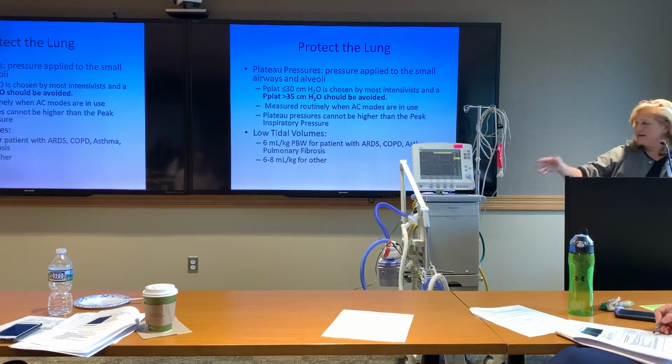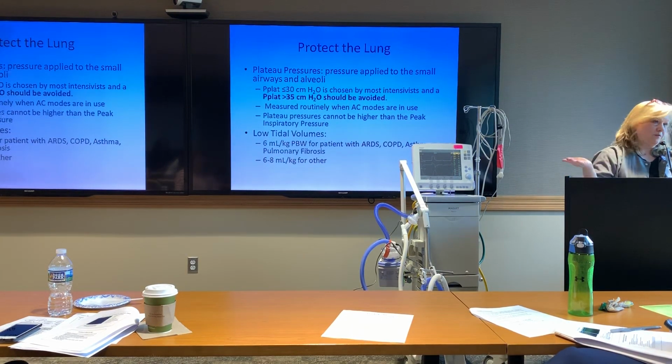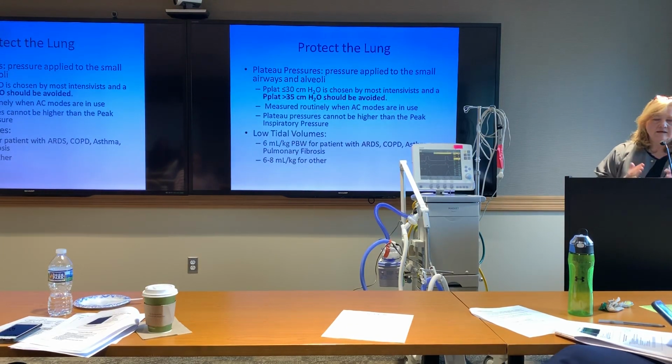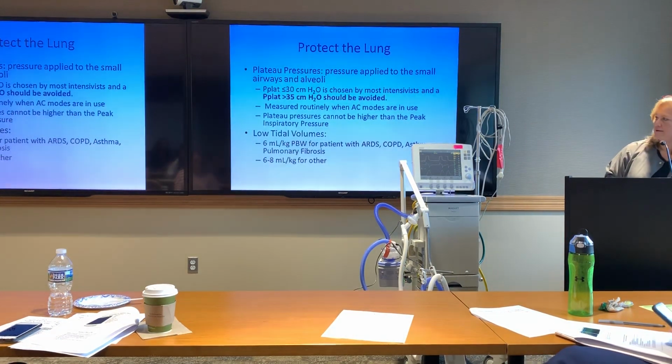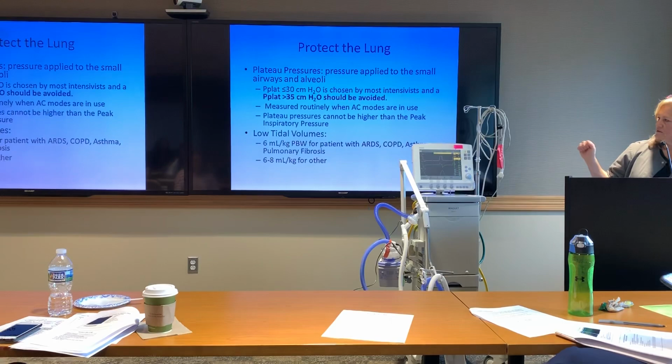Again, if I had an asthmatic, I might have peak pressures of 50, but I do a plateau because most of that air isn't actually getting down to the alveoli. It's just being stuck, getting through all the restrictions. I may have a plateau pressure of 20. That's somebody who has a lot of airway resistance. That wouldn't be an unsurprising thing to find. Again, not common in your patients because you don't have a lot of asthmatics who get head injuries, but they certainly can, but they're not in there for asthma, so their lungs are probably okay at the moment. But anyway, it's just a general reminder. If their pressures are higher, you want to know what the plateau pressure is. And I talked about lower tidal volumes.